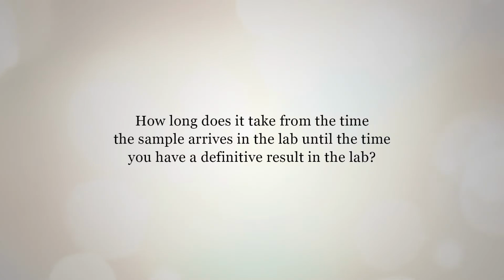Our instruments are connected to the lab information system, and the data flows out to our public health partners for contact tracing or to HealthLink for calling out the negative results. We're aiming for about 24 hours. A sample comes in, and within 24 hours we can get the results out, is what we're aiming for.